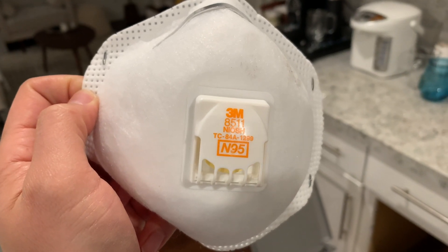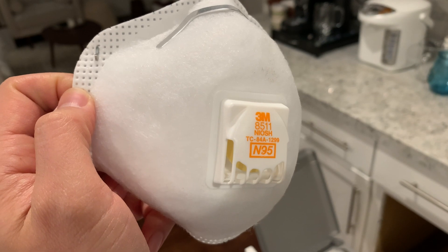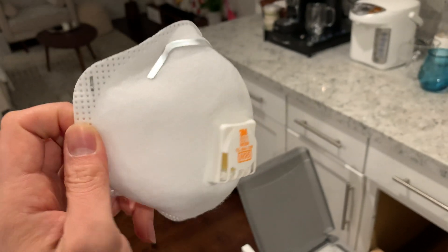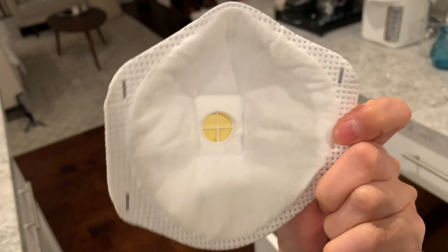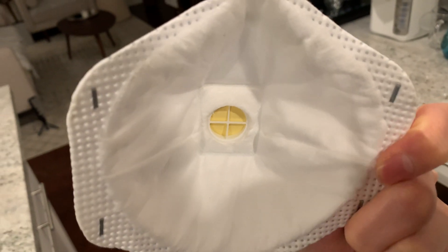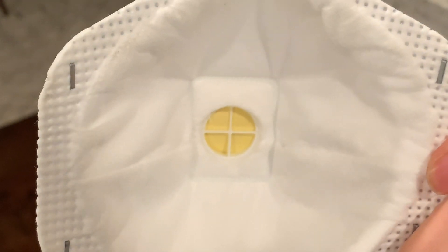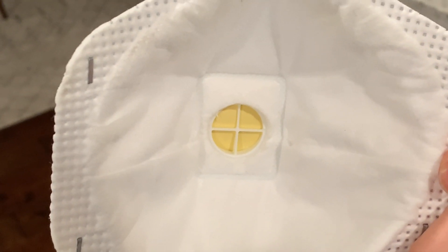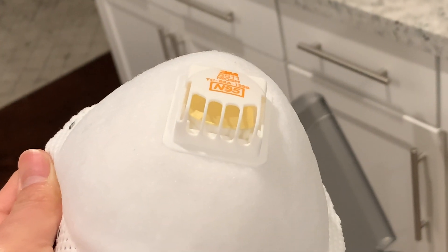Look at the 3M 8511 N95 mask. This is the one that I finished using. I was going to throw it away but I noticed this mechanism inside. Basically it's like a valve — if you blow air from inside, this mechanism lets the air out faster. Let me show you a demo.